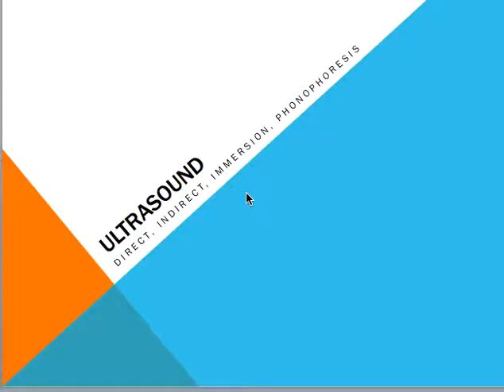This week with Module 5, we're entering with a new group of modalities under the heading of ultrasound. There are 4 general ways that you can apply ultrasound: direct technique, indirect with the bladder or gel pad, the immersion technique underwater, and then phonophoresis where we use a medicated medium. So again, most of the information is in the book, and I guide you along with the study guide. There are a few things that I wanted to point out though this week under ultrasound.